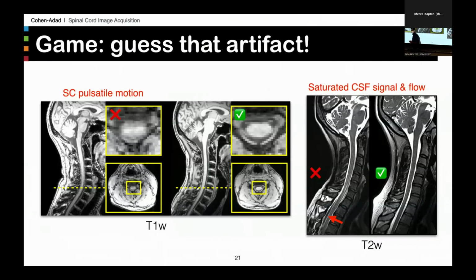Julien, because you also have a hyperintensity in the cord, in the anterior portion, right? Up above that part, that white band. This one? Is that related to CSF flow too? Somehow? It might be, some people have a slightly bigger canal. Could be that.